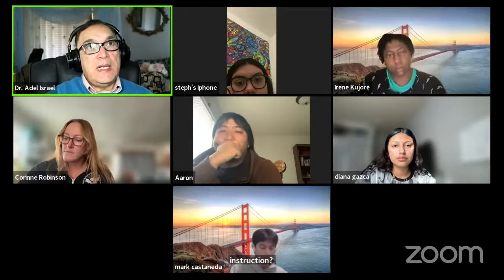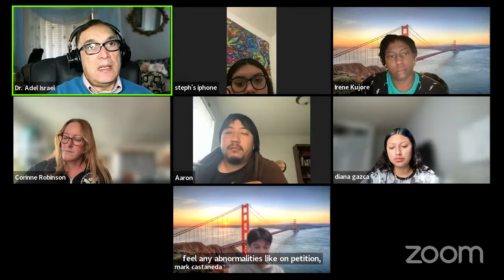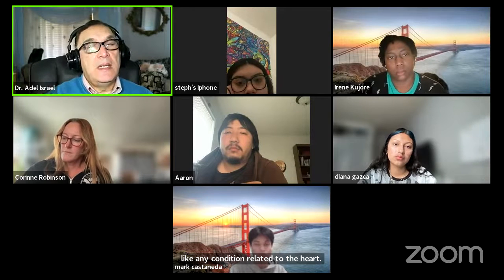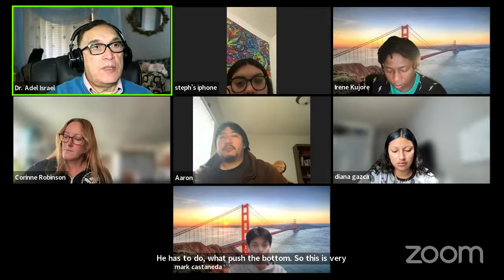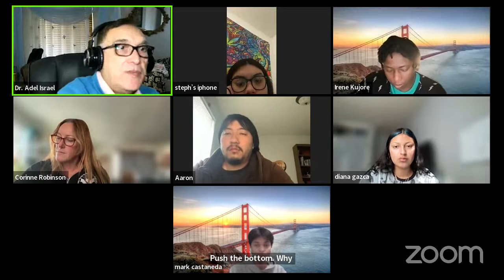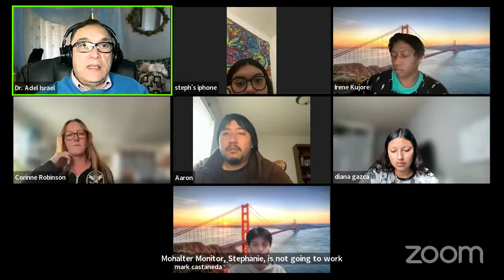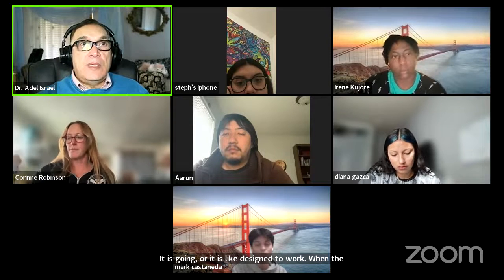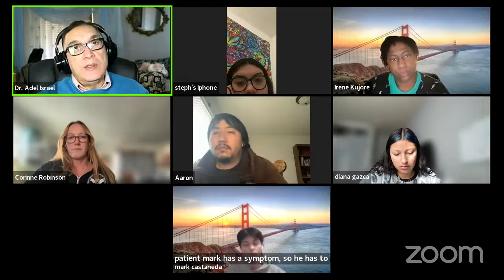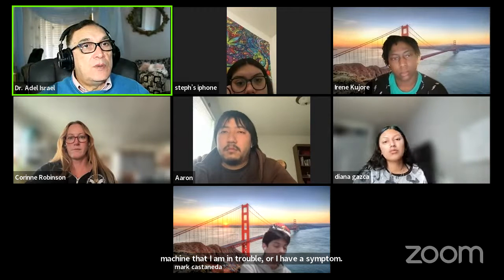When the patient feels any abnormalities, like palpitation, chest pain, or any condition related to the heart, he has to do what? Push the button. This is a very common phrase in the exam. Push the button. Why should he push the button? Because the Holter monitor is not going to work 24 hours. It is designed to work when the patient has a symptom. So he has to tell the machine that I am in trouble or I have a symptom. So the machine will start to record what is going on with the heart.